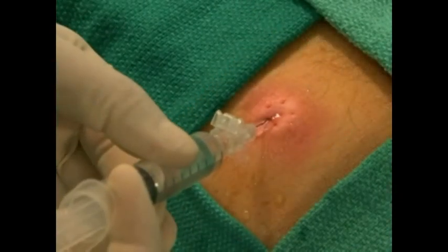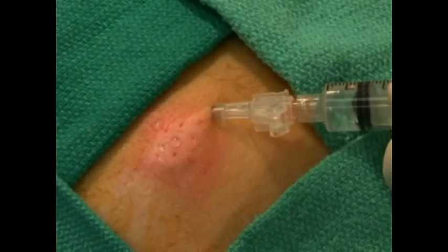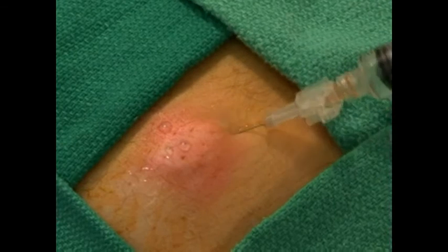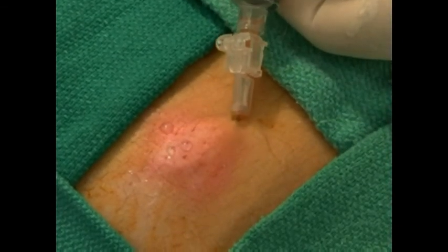Continue with infiltration until you have covered an area over the top of the abscess large enough to anesthetize the area of incision. Some abscesses may require additional injections of anesthetic in a local field block pattern or moderate procedural sedation for additional patient comfort.